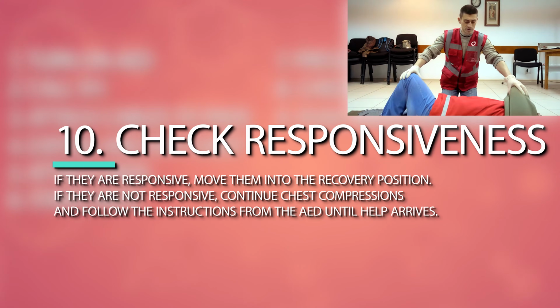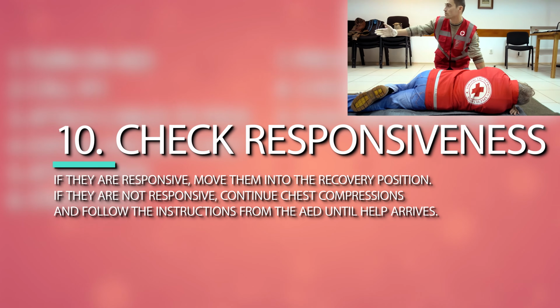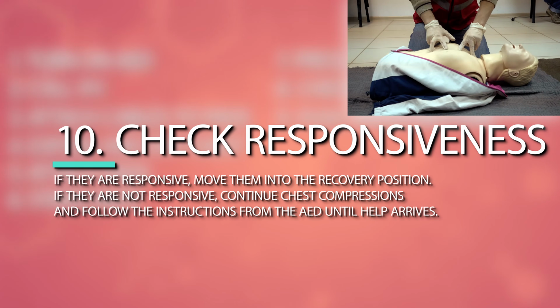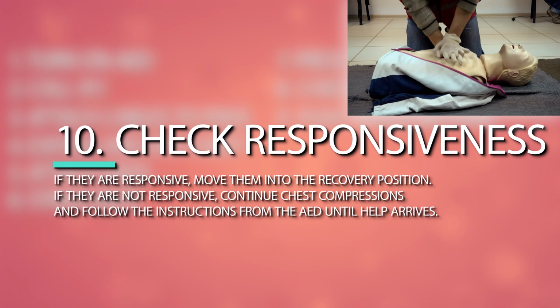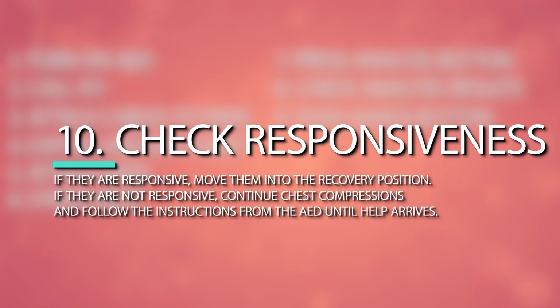Step number 10. If the individual is responsive, move them into the recovery position and leave the AED attached. If they are not responsive, continue chest compressions and follow the instructions from the AED until help arrives.